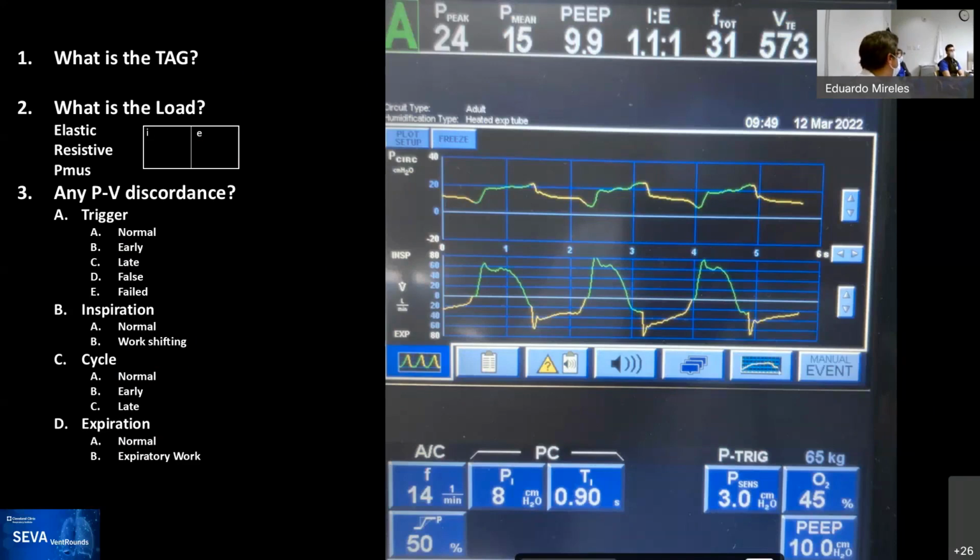You want to read this one? Isn't it the crickets? I want to know what you see. Okay. All right, you're gonna try it? I can give it a try. All right. Go for it. Have no fear. I'm always there.